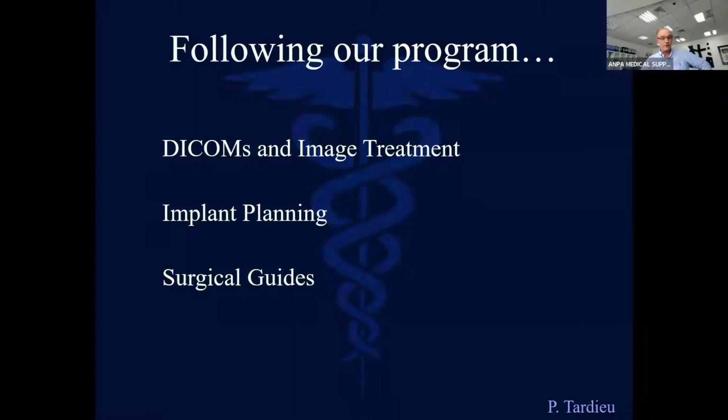Of course, it's very important. It's important because the surgeon is responsible for the implant planning. Here at ANPA, we propose to you some implant planning, but you need to validate the implant planning. And implant planning might be different following your objectives about the restorative dentistry on implants, and about what you have and your skill in making more bone or not. So based on all this, the implant planning might be different on the same case. So you need to sign your implant planning because you are responsible for that.